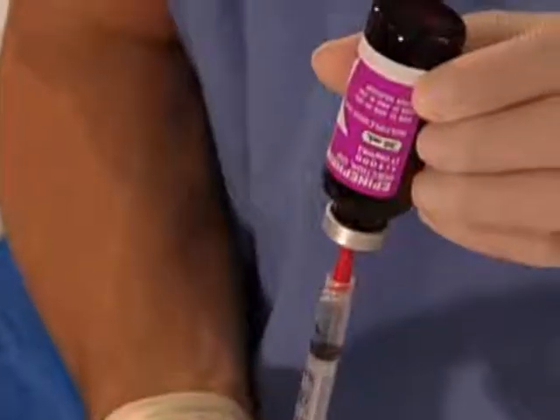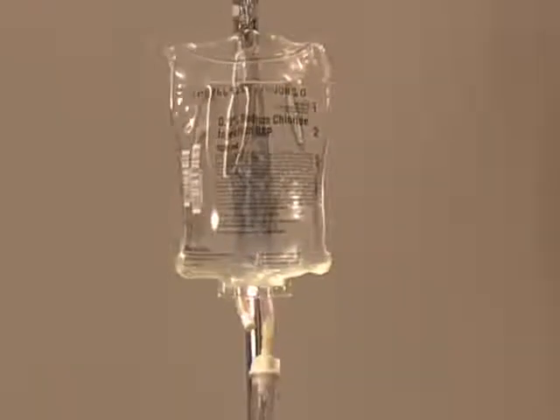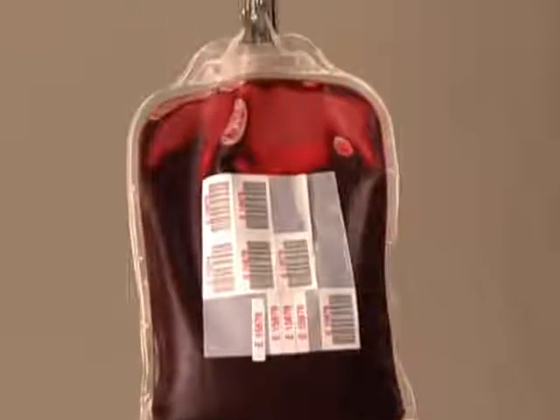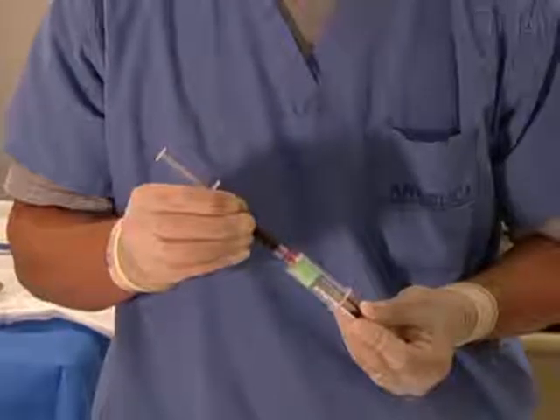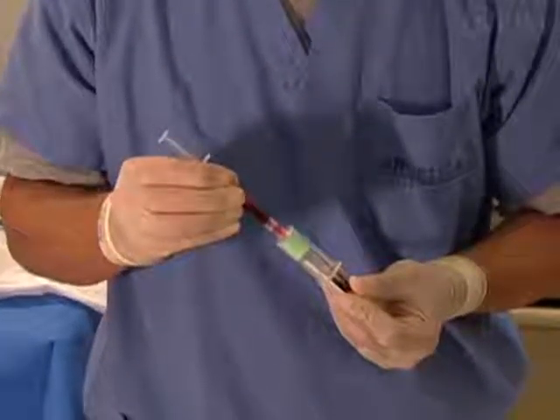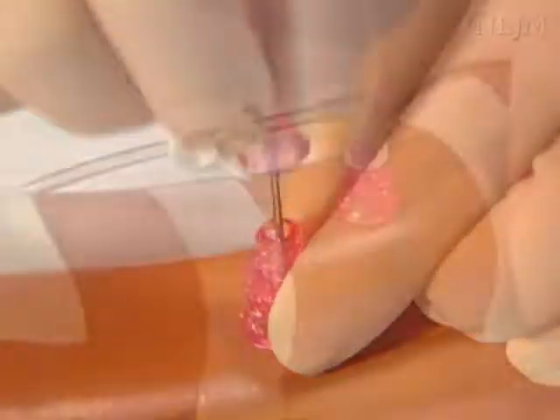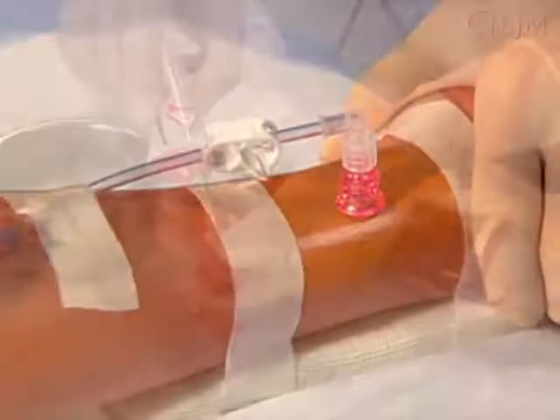Intraosseous access provides a rapid and reliable means for delivery of medications, crystalloid fluids, blood, and colloid products during pediatric resuscitation. In addition, when intraosseous access is achieved, blood samples can be obtained for laboratory analysis. Numerous studies show that an intraosseous catheter can be placed more rapidly than a central venous catheter, and that this technique is more reliable than venous cut-down.